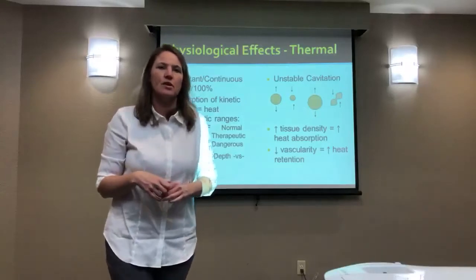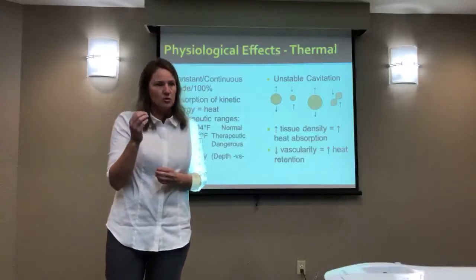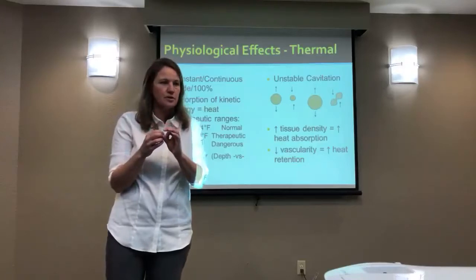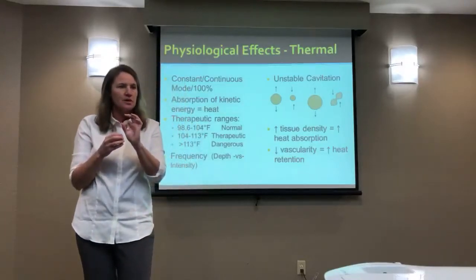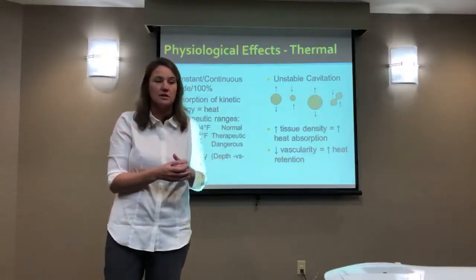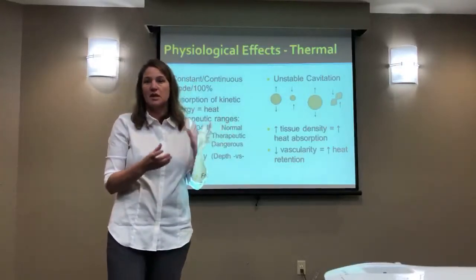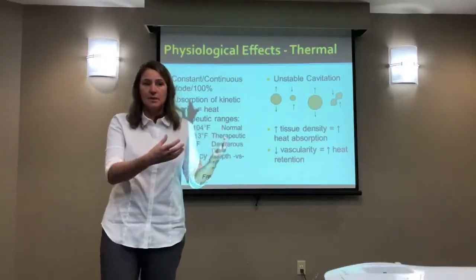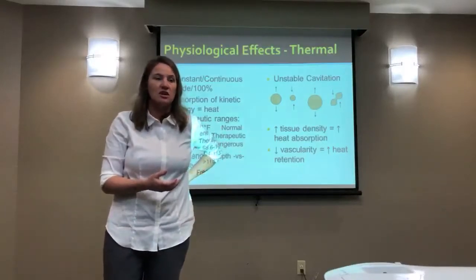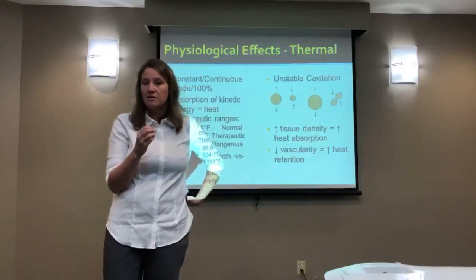So what happens with ultrasound is that when you pass ultrasound through water, you're agitating it, and you create little gas bubbles. The higher the frequency, the smaller the gas bubbles are going to be. So you're going to create these bubbles at a size related to the frequency that you're using. Because we know that ultrasound creates bubbles in a liquid environment, it's anticipated that because our bodies are mostly liquid, it's creating cavitation in our soft tissues.